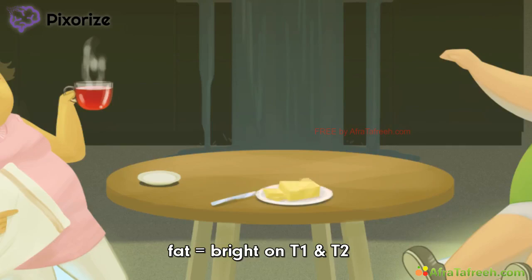Now turn your attention to the middle of the table. See the plate of butter? This should help you remember that fat is bright on both T1 and T2 imaging. And I think our party guests here may have had a little too much.